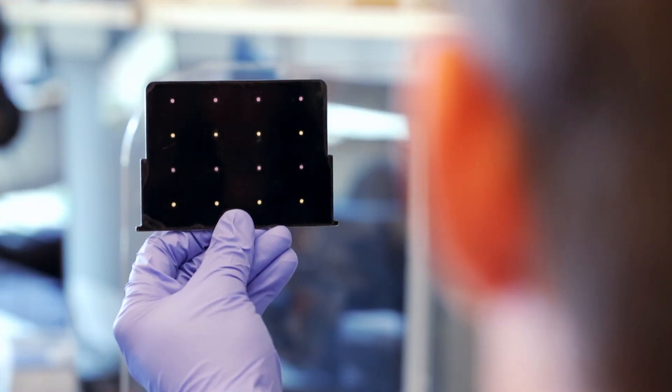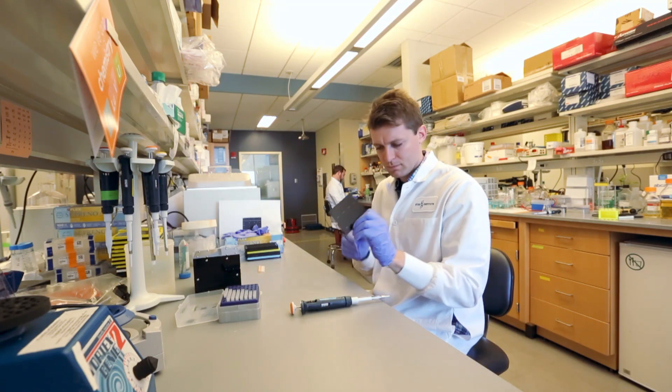Having something so simple, so portable, so quick is stunning to the countries now struggling with the virus. When you talk to groups in Ecuador or Brazil and explain what you've got, the response is great excitement and interest. They're really thrilled by the low cost, the rapidity, and how easy it is to use — and they're eager to get to it and use it as quickly as possible.